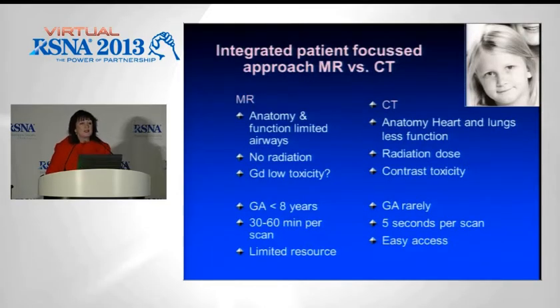So this must be an integrated approach. I think it's very important for me to put cardiac CT into context. There is no competition between cardiac CT and cardiac MR. They are very, very synergistic. They sometimes are both needed, but they both have strengths and weaknesses. And it's also important to make you think that those decisions must be discussed in a multidisciplinary team meeting, and then decisions made as to which test to go ahead and do, or whether indeed you need both.